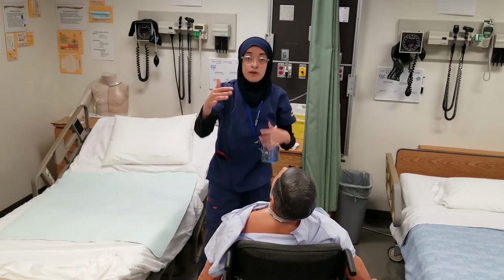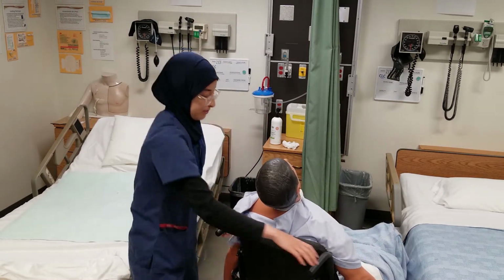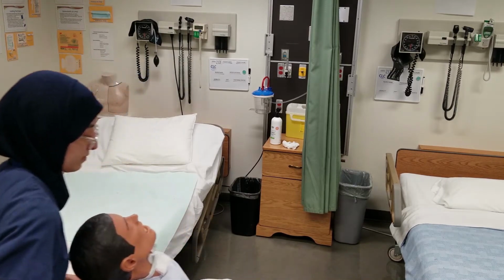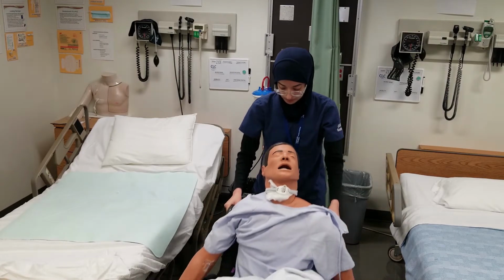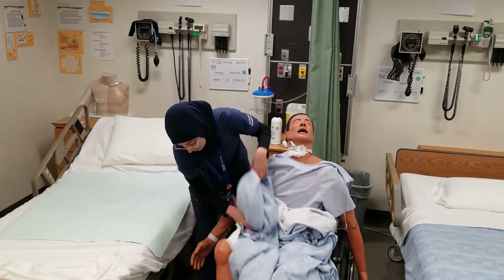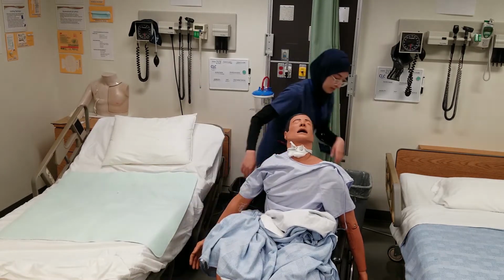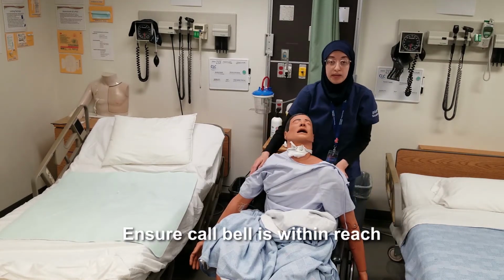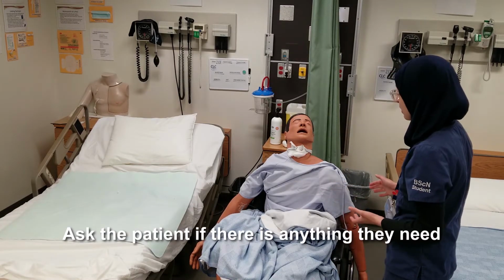And then the patient may want to be repositioned if they want to watch TV or face a window. I want to make sure that if I'm leaving the room, I am setting the brakes, and that the call bell is within reach. So I grab the call bell, put it in the patient's lap. All right, Chris, you're all set to go. Do you have any questions at all?